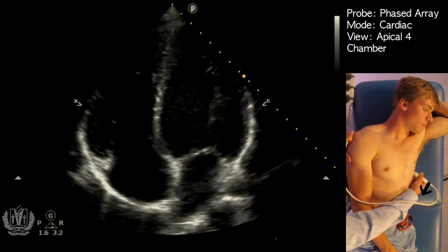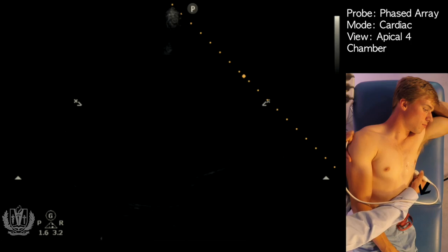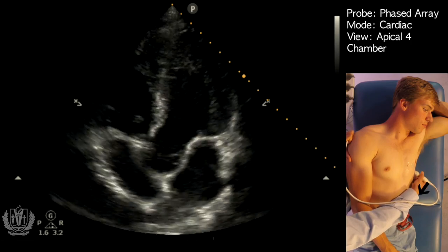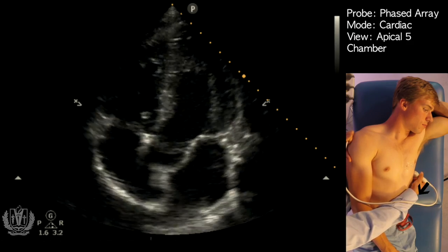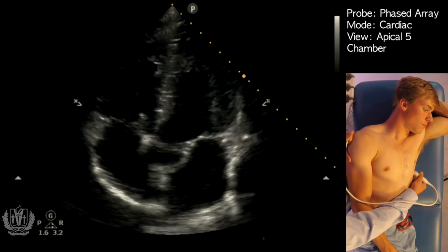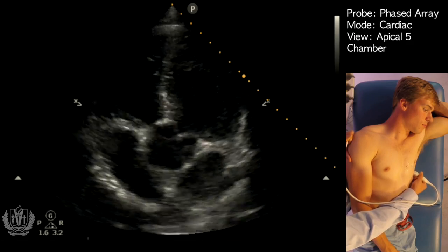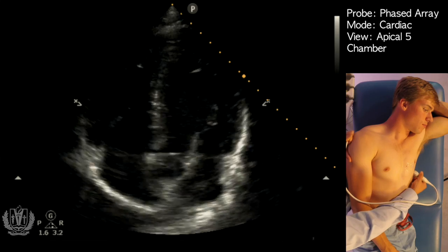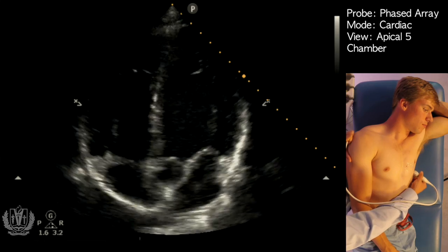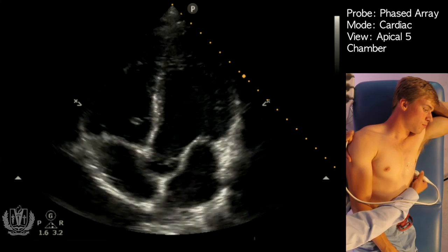If you go even more superiorly towards the head, you'll get the apical five-chamber view. This is a more advanced view used for cardiac output assessment.